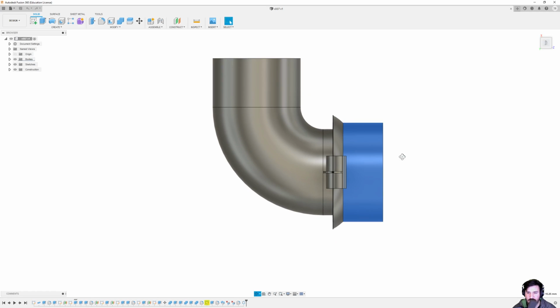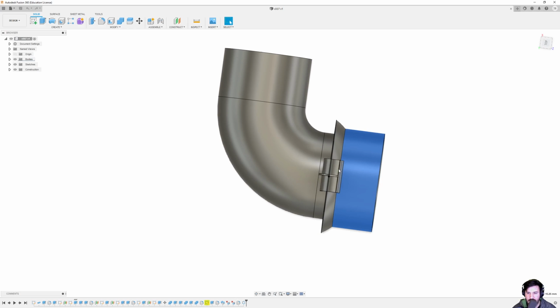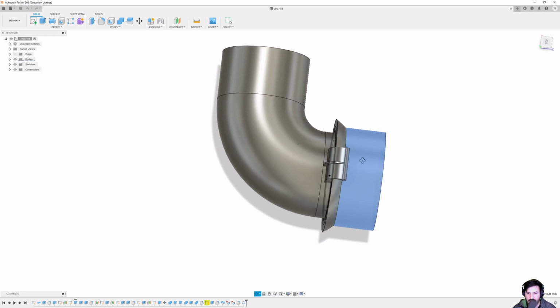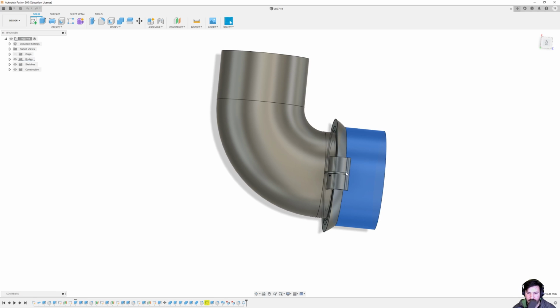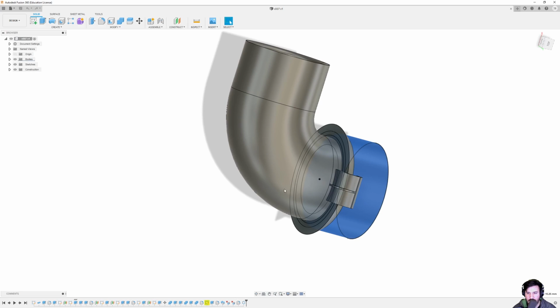So in the end, what I ended up doing is printing in this orientation here. And that means that vertically up and down right here, it's brittle horizontal like this, but the clasps, whatever they want to call them, they don't ever flex up and down like that. They flex in and out like this. And so because all of the layers were horizontal like this, one layer could flex and it wouldn't try and separate layers.